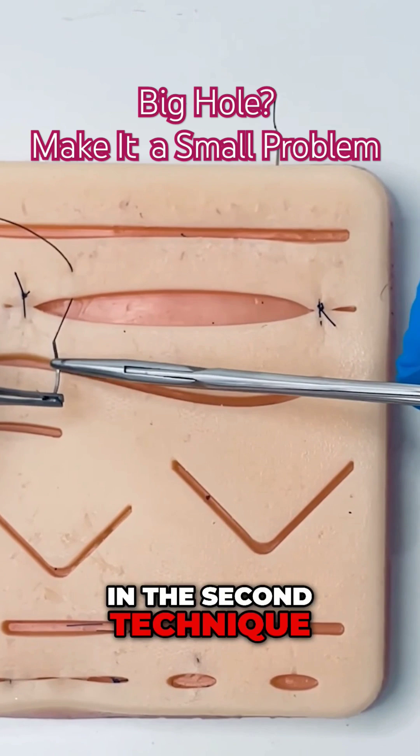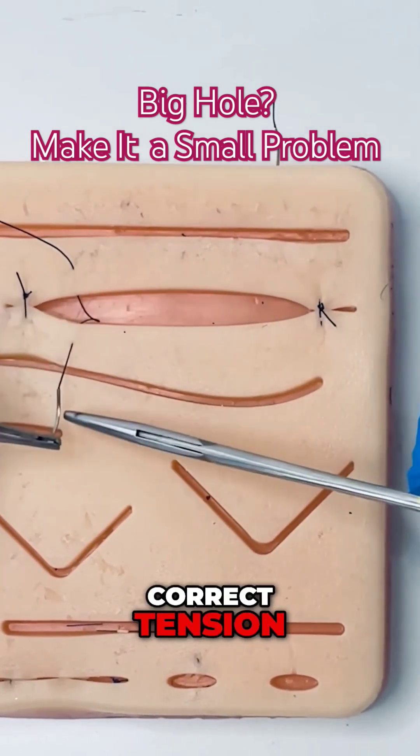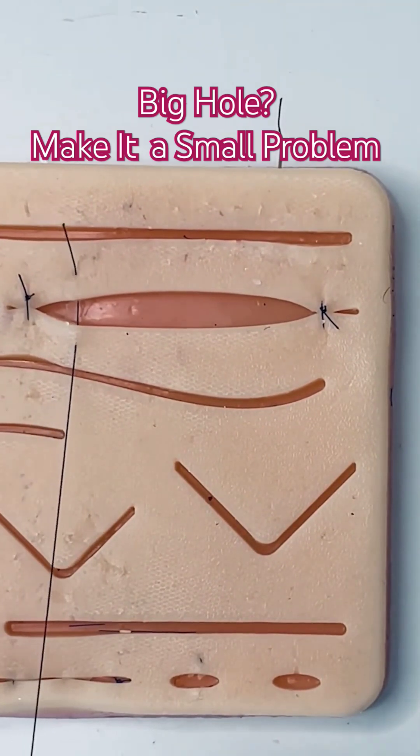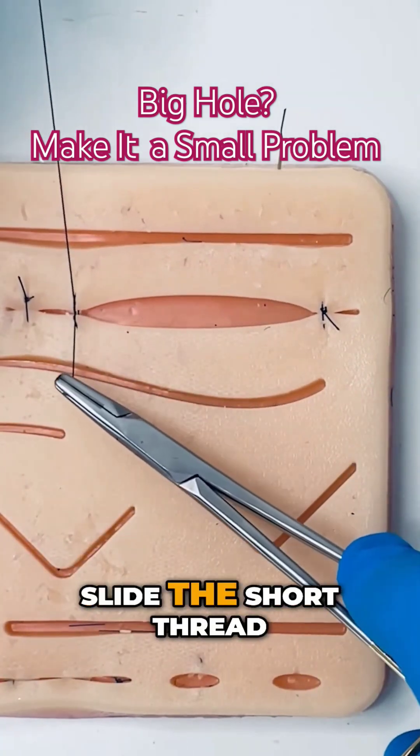In the second technique, after you lay your surgeon's knot to the correct tension, you keep the long thread taut and you slide the short thread through it.